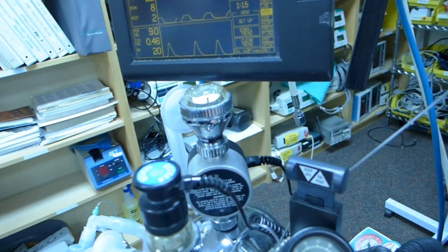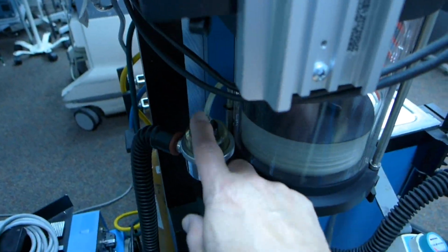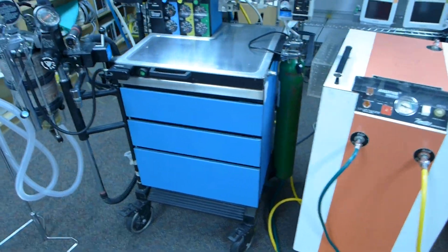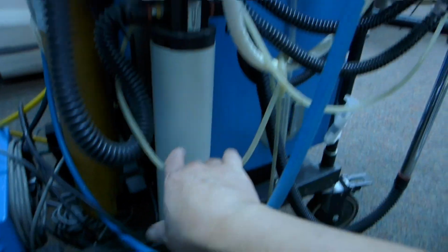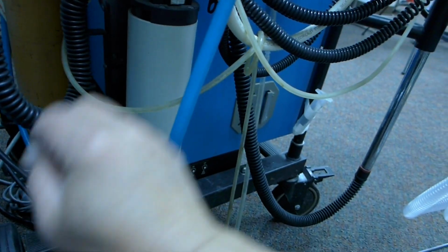Yeah, this one has a PEEP of about 2. What that means in this case is that sometimes this PEEP is coming from here in the back. Okay, and I'll explain to you why. On the back here, I'll show you that this is a scavenger system. Normally we will have another hose that actually pulls the waste gas out of the operating room.